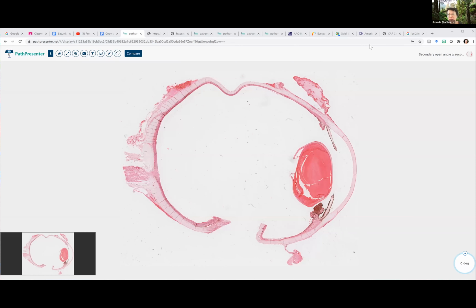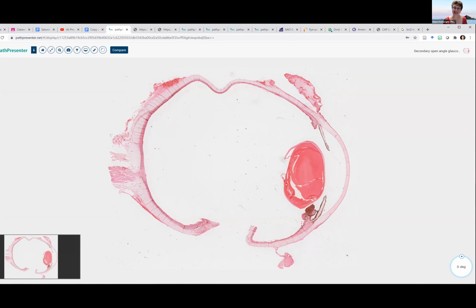That'll be me, and then we'll take another break. Oops, I have to log in again. That's right, auto login. Share screen. Okay. I did all the ones with the tumours, so they're easier. Lucky you. Well, of course, we see tumour eyes, but we don't get enucleated non-tumour eyes.